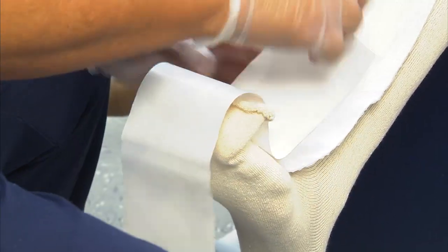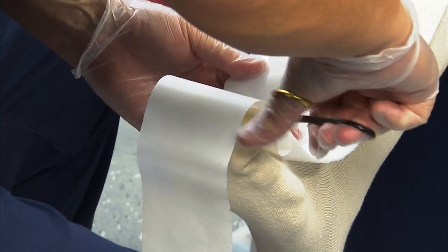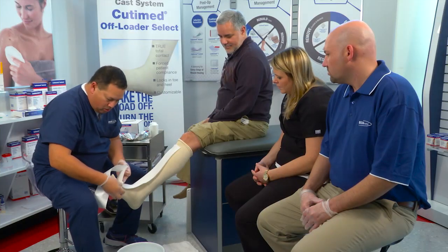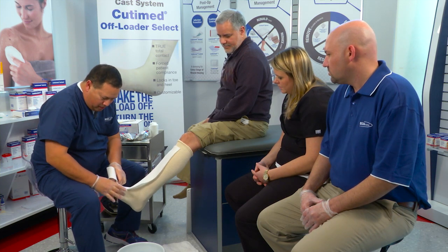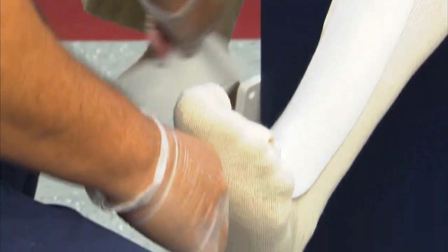I'm going to come to the end, and I want to cut this foam on the paper, because if I try to cut before, it's going to stick to the adhesive. I'm going to latch this piece down like this, and just massage that down so it's nice and wrinkle-free.